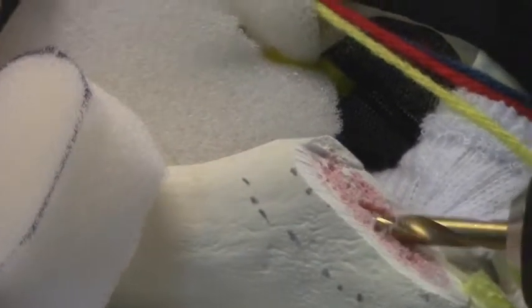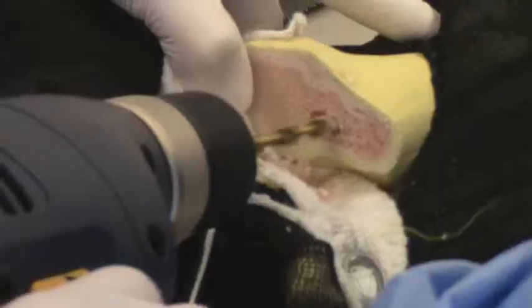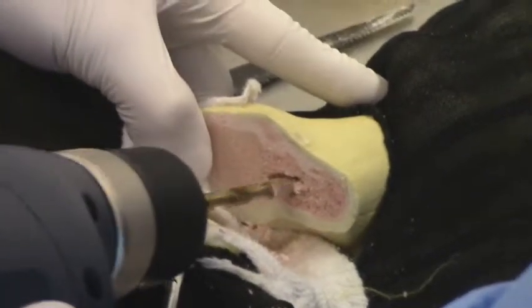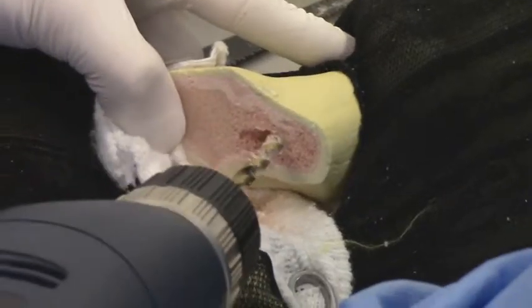It is important that a member of your team hold onto the distal femur to stabilize the limb. Do not hold the femur anywhere close to the hip. In some cases, the drill bit will break through the bone and you don't want the drill bit to hit your hands. Continue to use the drill bits to shape the femur. With larger drill bits, it will be easy to see the particles of bone flying away from the surgical site. Be vigilant with the vacuum.